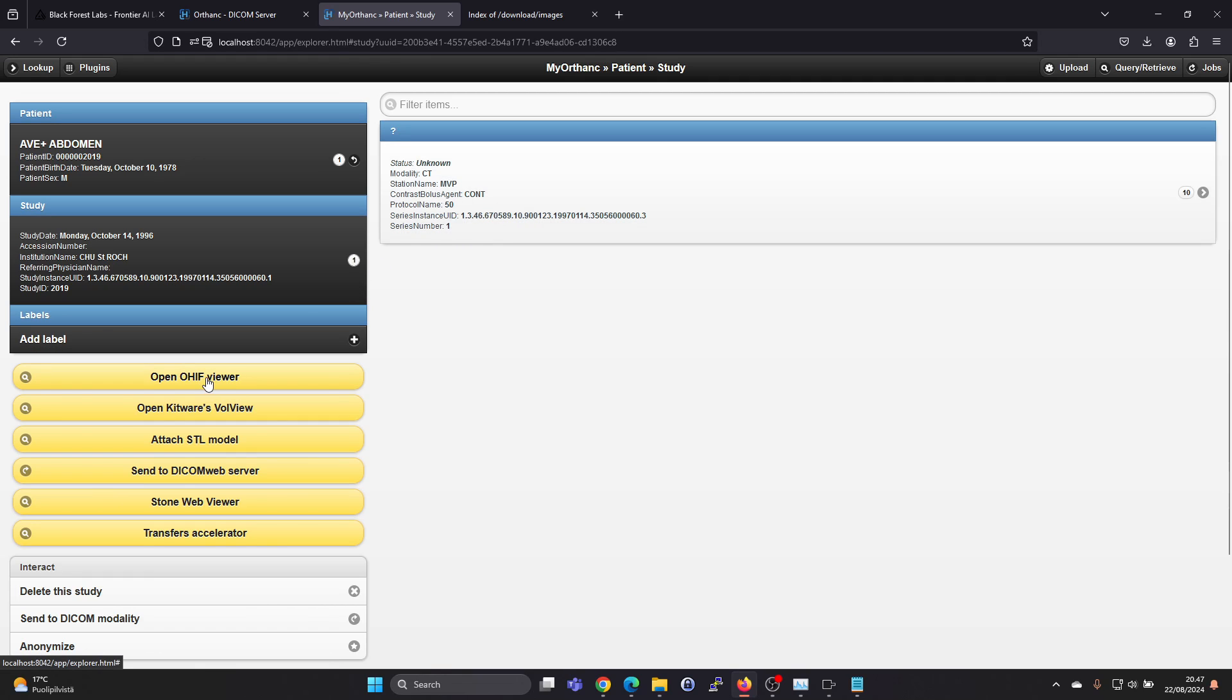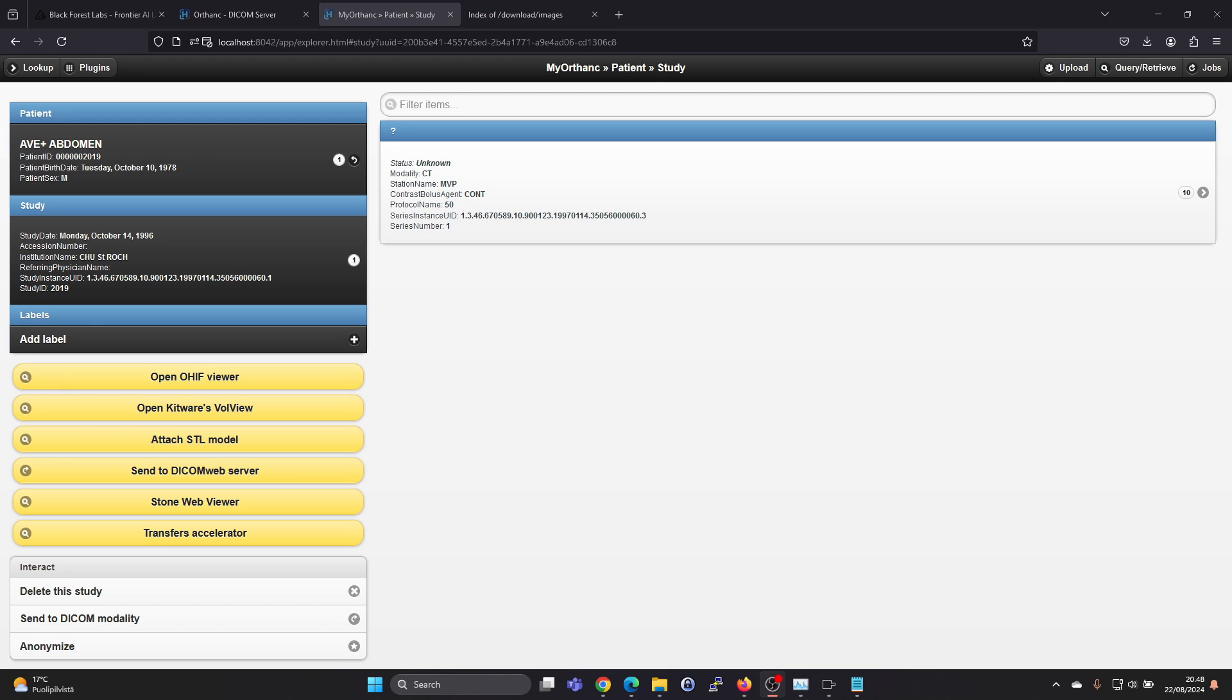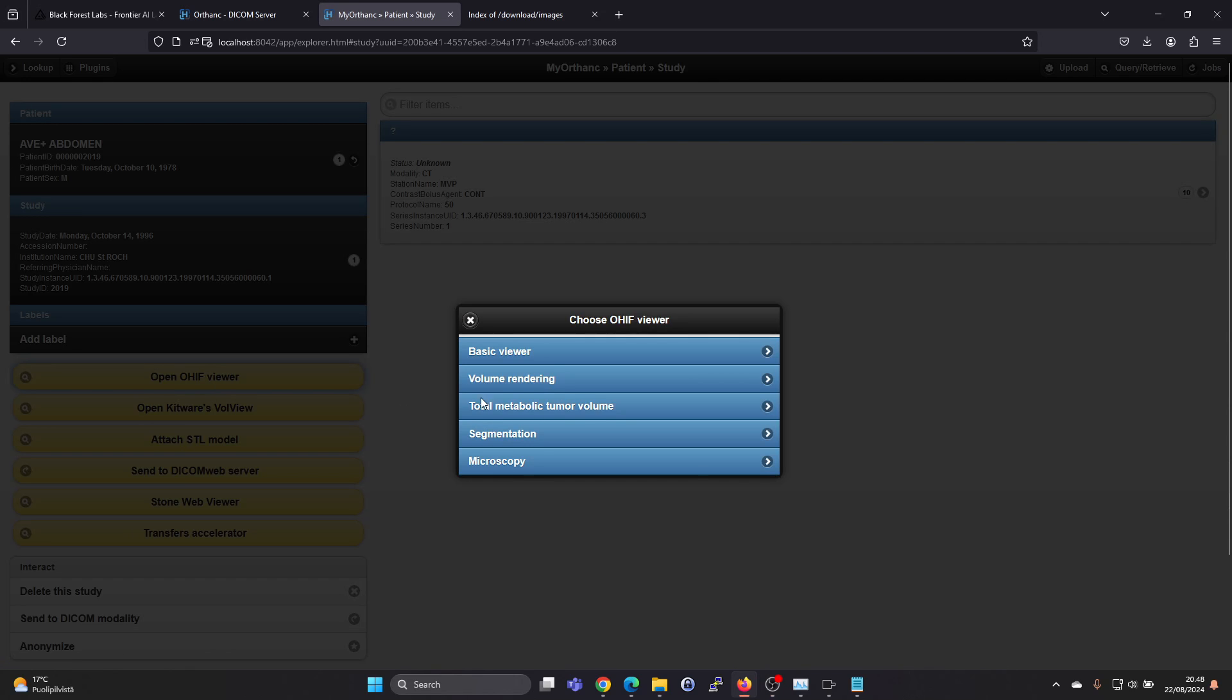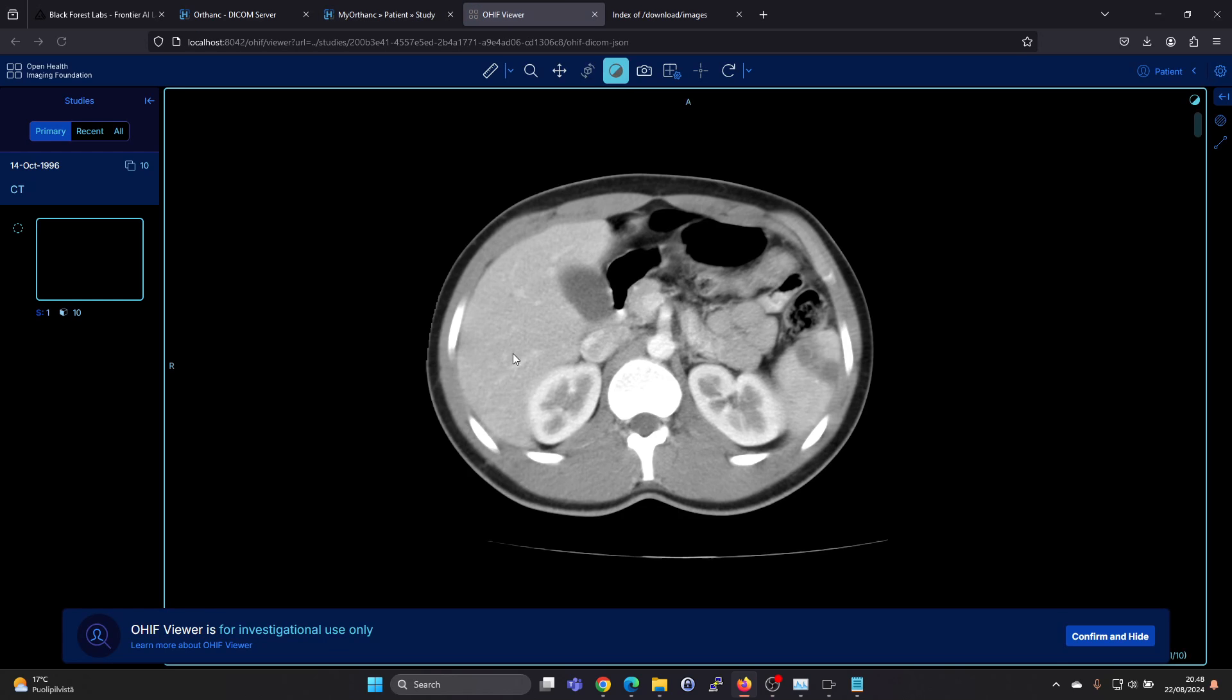And here on the right hand side we have the study. And we have multiple options. So this installation came with the OHIF viewer. This is also an open source viewer. So we can just click here and then select basic viewer.